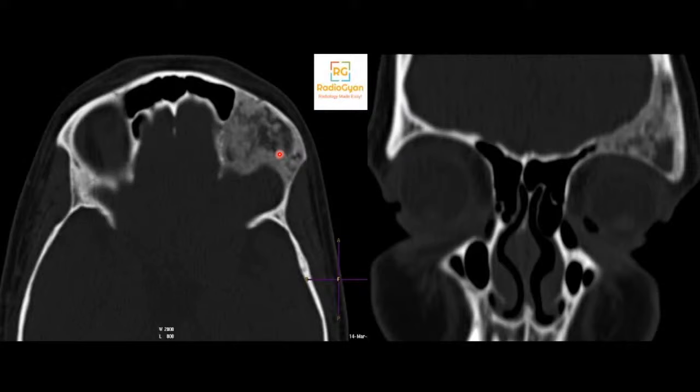Perfect. Okay, Sayan, you rightly pointed out the mnemonic is FEGNOMASHIC. I'll just expand that mnemonic. F stands for fibrous dysplasia or fibrous cortical defect. E is for enchondroma or eosinophilic granuloma. G is for giant cell tumor or a geode, that's a subchondral cyst. N is for non-ossifying fibroma. O is osteoblastoma. M is mets or myeloma. A is aneurysmal bone cyst. S is simple bone cyst. H is hyperparathyroidism or Brown's tumor. I is infection and infarction. C is chondroblastoma and chondromyxoid fibroma.